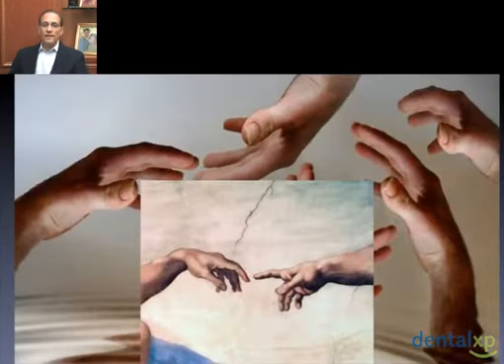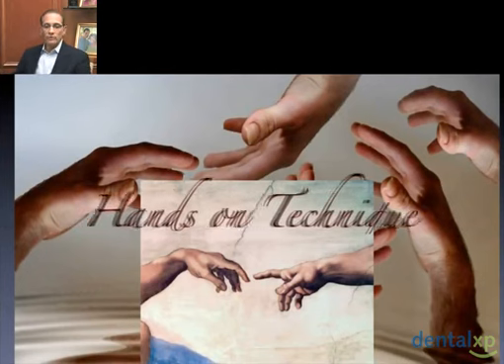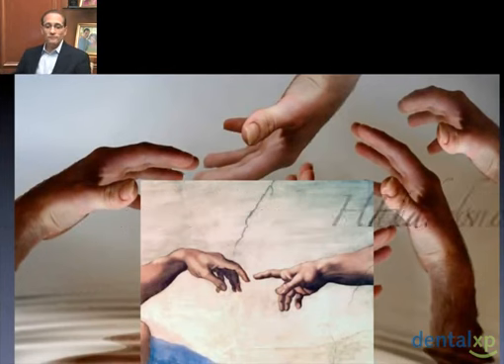At this point, we're now into the hands-on part of the presentation, where we're actually going to go to the laboratory and create a provisional, just like I did with what I call the indirect direct technique. We don't have a patient here today, but if you can imagine the patient in the other room, and we've sculpted our tissue, and now we've quickly moved on to the laboratory phase. We can create the provisional. So we're going to take some time and create the provisional on a model so that we can go through the steps.